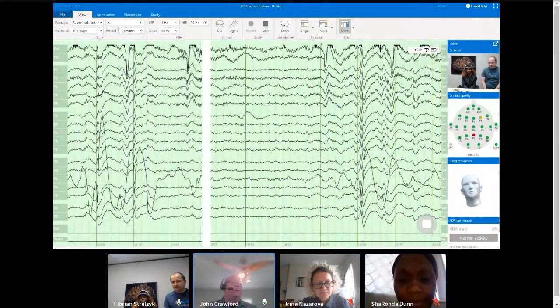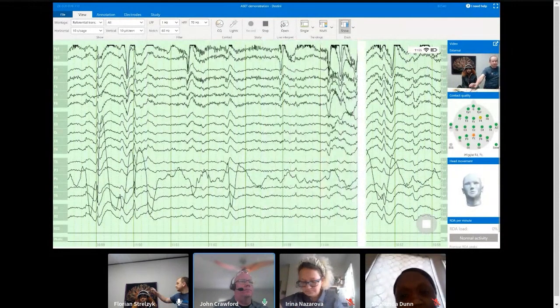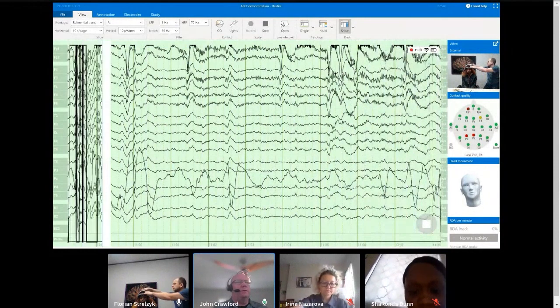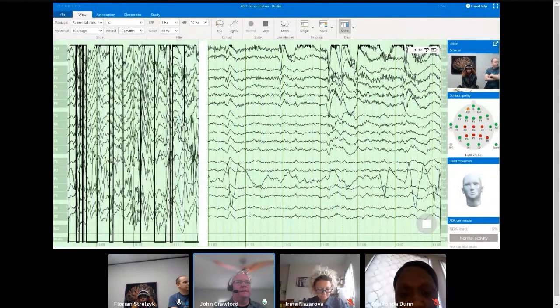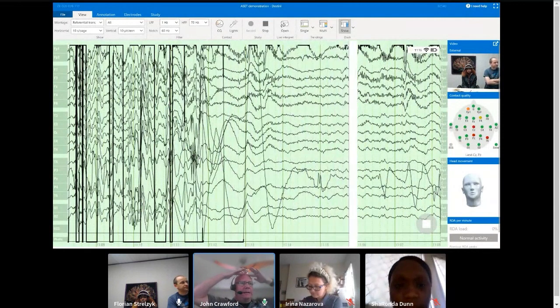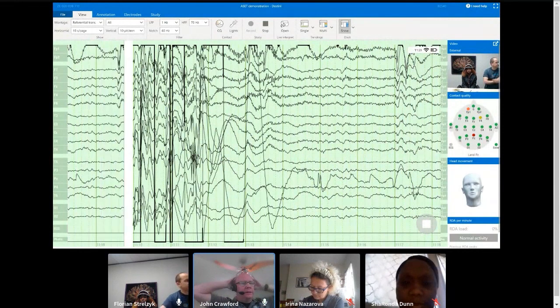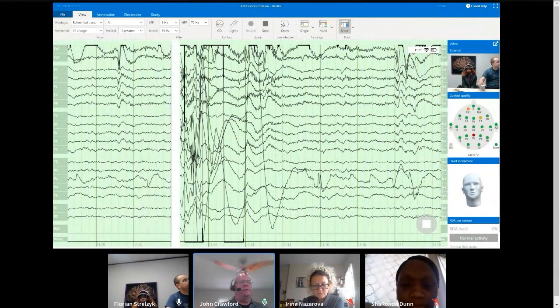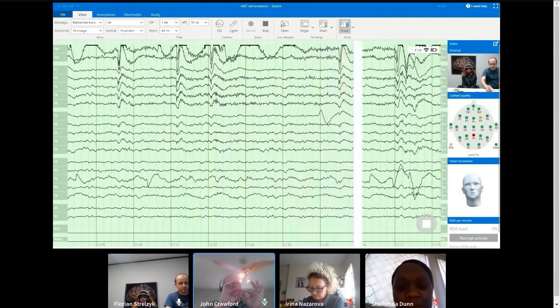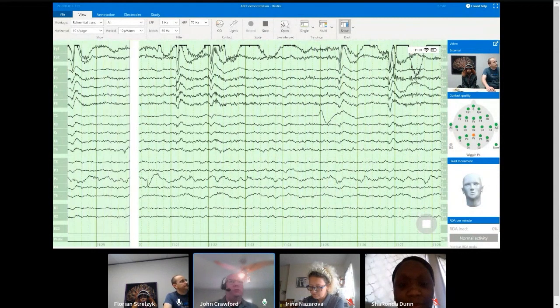Those are great questions, Sharonda. Let's start with the wig first. With the wig, it's just like traditional EEG. Those electrodes have to be able to touch skin. So let's say the wig only peeled back and then it was sewn in from this point going backwards. It has to come out. We have to be able to touch skin, or if they're using a netting, then sometimes you can separate that netting a little bit, just like we would with traditional EEG.